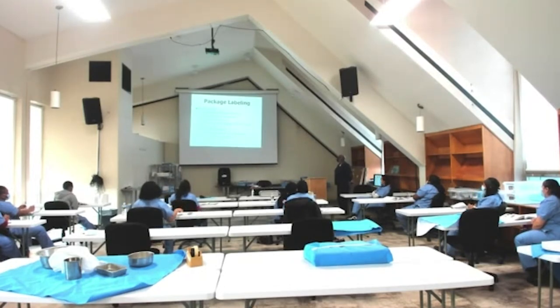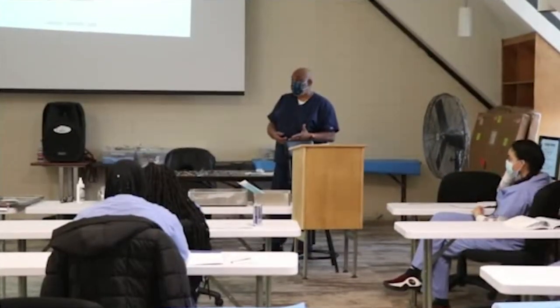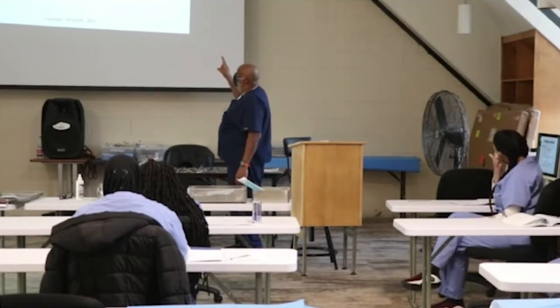Labeling is from each end of the process, okay? Prep and pack, your initials. If it's an automated system, meaning you scan the tray before you assemble it, Gabriella, you scan your badge and you scan the tray, so it will associate with you automatically. In a manual system, you'll sign your name on the count sheet. At some point, we have to identify who assembled the tray.